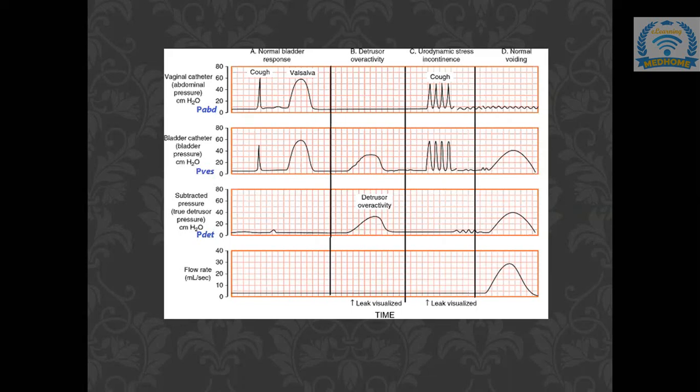Yeah. But in the exam, when we are solving the questions in so much confusion and stress, sometimes the options are so close by, like stress incontinence and urodynamic stress incontinence. We just randomly mark by mistake. We don't have that intention, but sometimes we do it. So we need to be very open-minded and clear in our mind that if the graph is there, we need to mark it as urodynamic stress incontinence. And if it is overactive bladder, in terms of the graph, we are going to mark it as detrusor overactivity. It's never going to be overactive bladder when it comes to the graph.